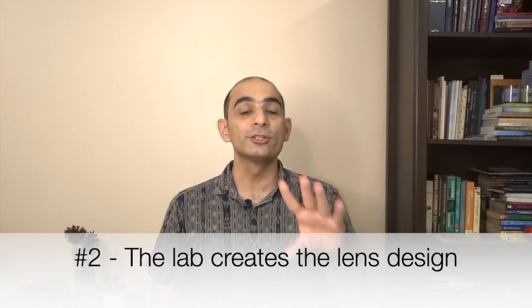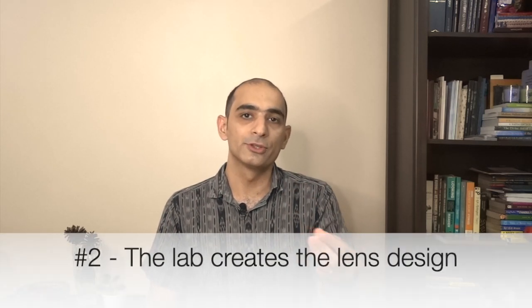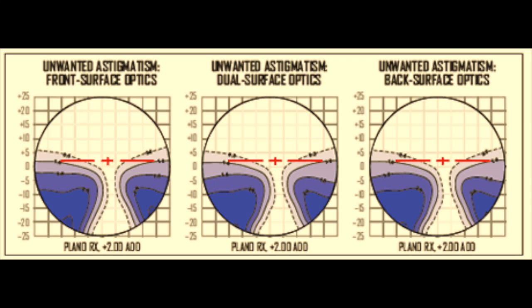Lens design. Using specialized software and algorithms, the lens design is created based on the patient's prescription and measurements. The software takes into account the patient's visual needs, the frame dimensions, and other factors to optimize the lens design.